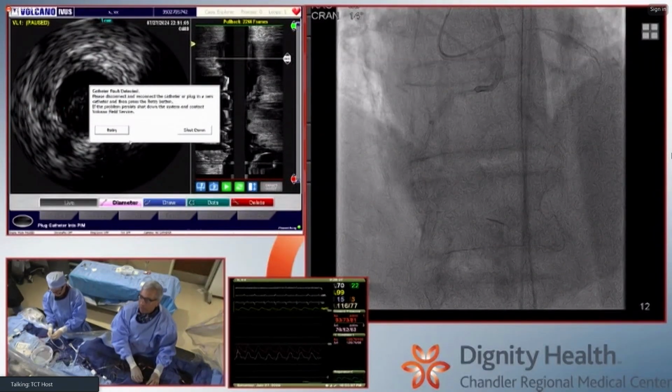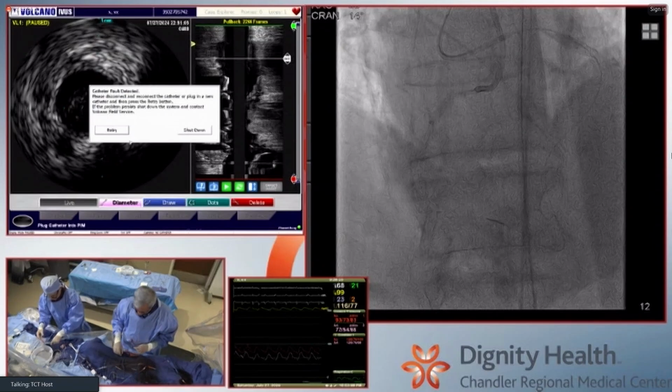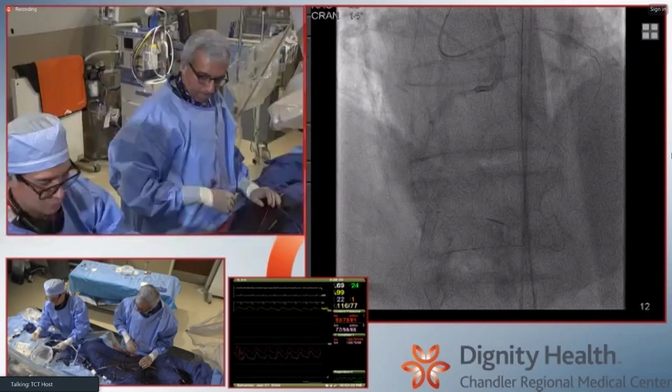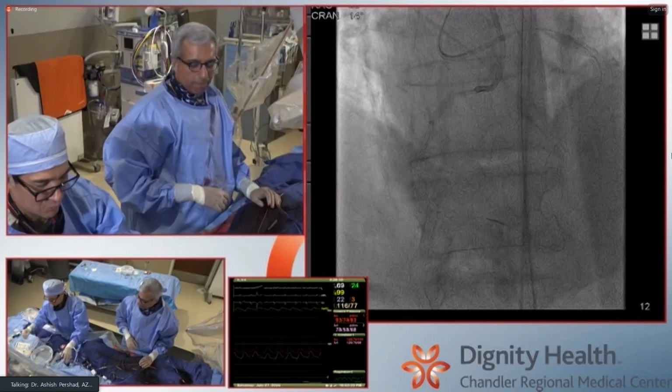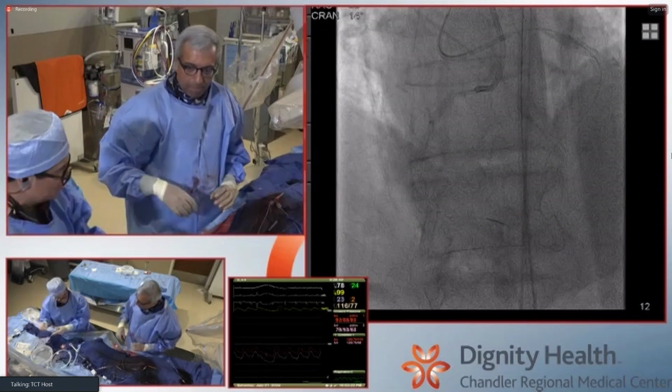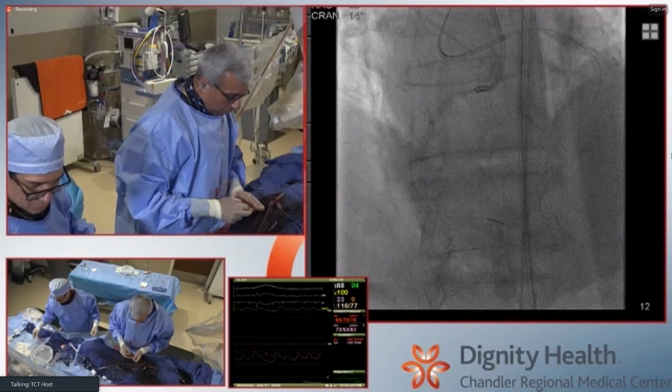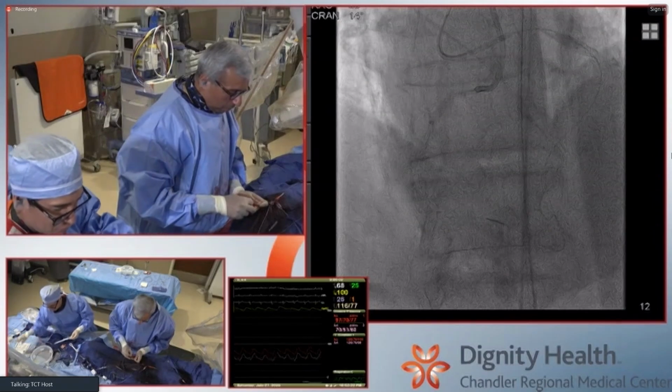Number three is the proximal intraplaque calcium, because that identifies the true calcium, and if that is big, we expect the subintimal calcium is big. In this case there is big calcium, not 300, but enough. So I do expect stent expansion into the subintima is bad. I'm not saying bad, but we have to be careful, otherwise we are chasing a perforation.